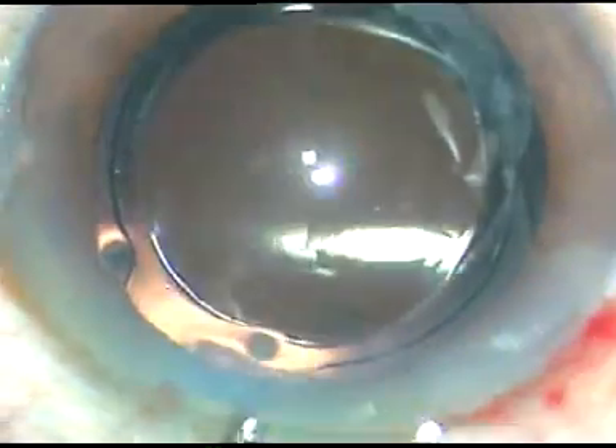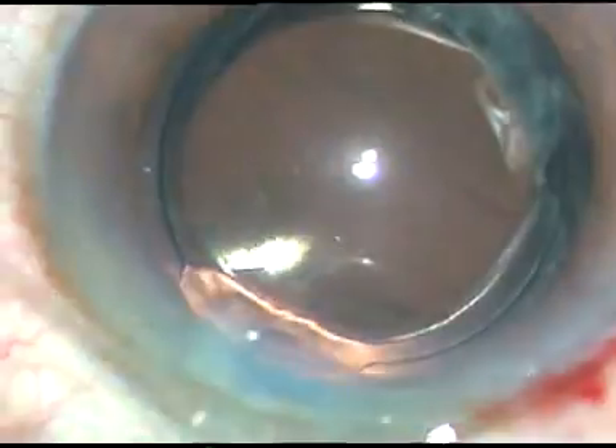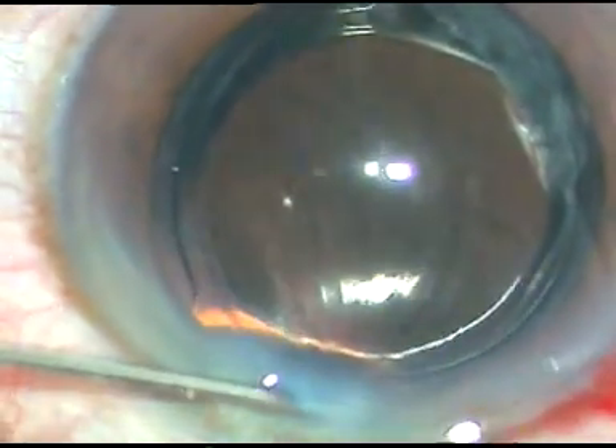This is a bit of moxifloxacin, and the moxifloxacin is being used to hydrate the stroma on either side of the side port.